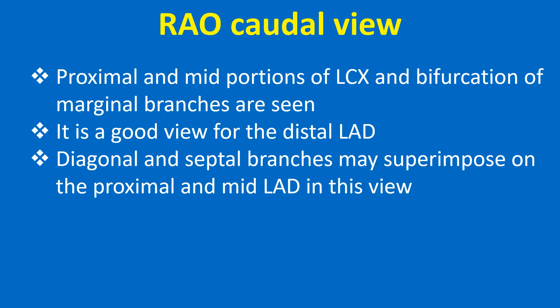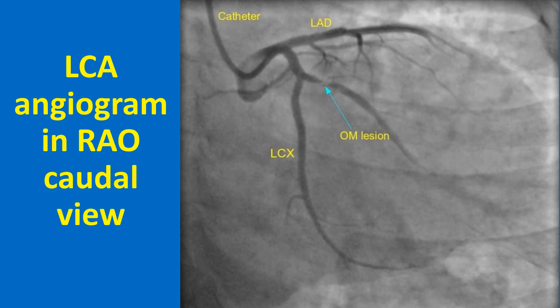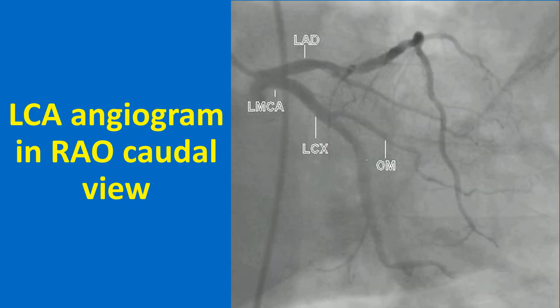Diagonal and septal branches may superimpose on the proximal and mid LAD in this view. A left coronary angiogram in RAO caudal view shows a tight lesion in the obtuse marginal branch of the left circumflex coronary artery, marked by a blue arrow in the proximal portion of the OM, which is a major branch of the LCX. In another case in RAO caudal view, the distal LAD is seen well, while diagonal and septal branches overlap the mid LAD as mentioned.